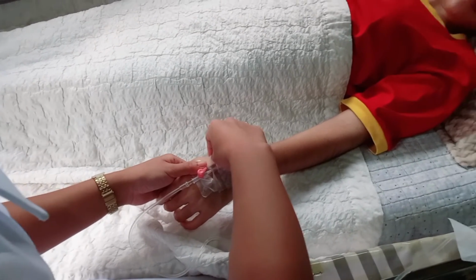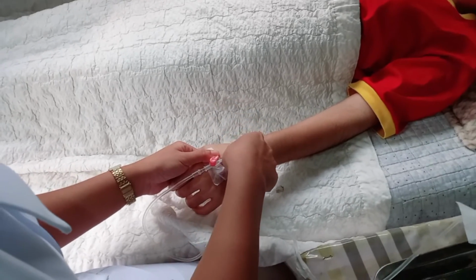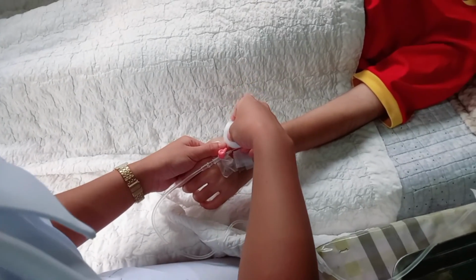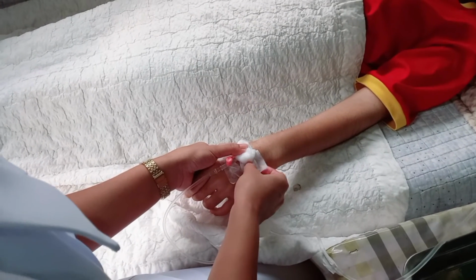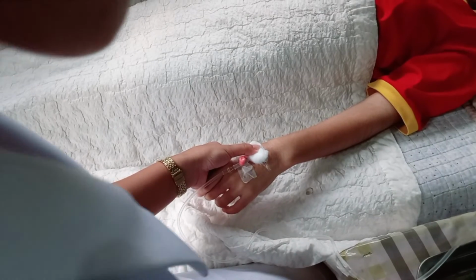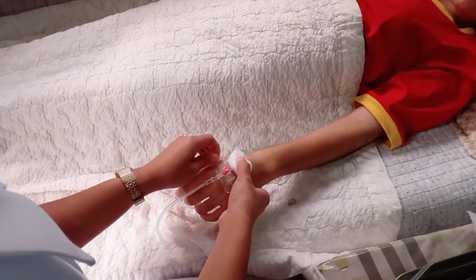And when loosening the plaster at the IV site, we will apply pressure to the needle and then apply the cotton ball and remove the plaster. Then we will quickly remove the needle.